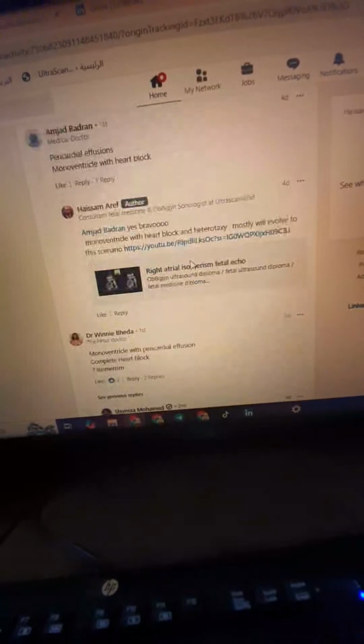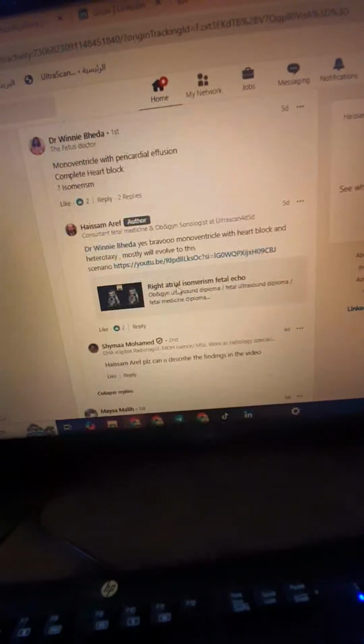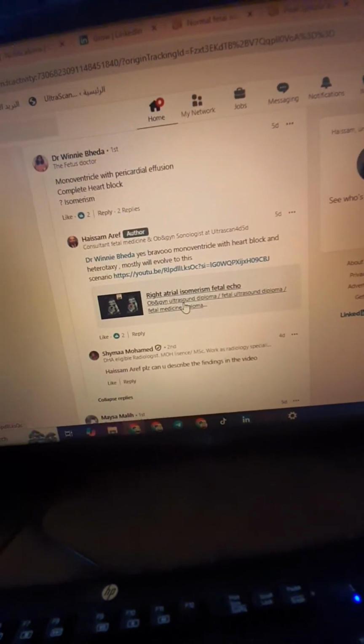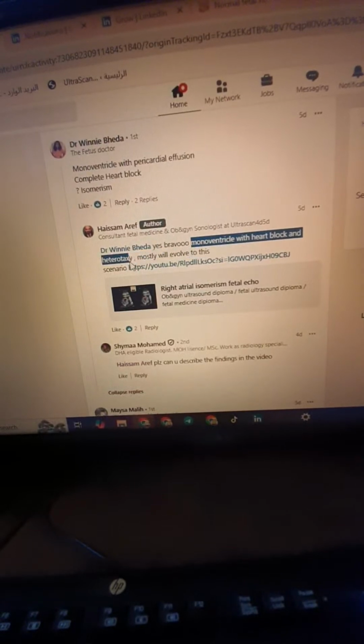This is the one. It is saying, please describe these findings in the video. Dr. Shaima, I guess you didn't see our previous lives depicting the right atrial isomerism, but let's say monoventricle with heart block and heterotaxy.